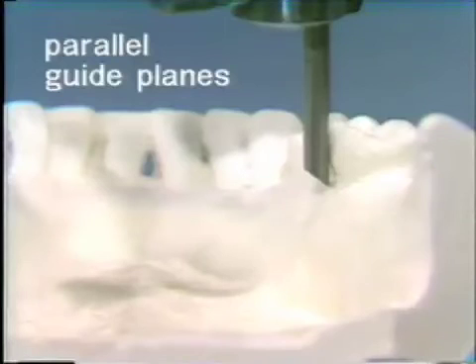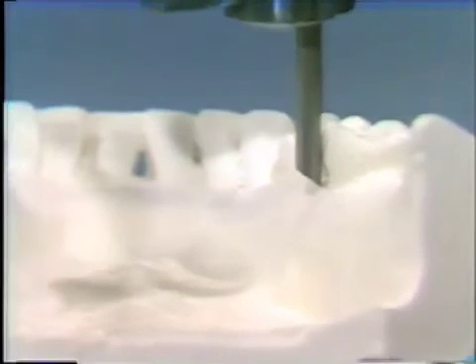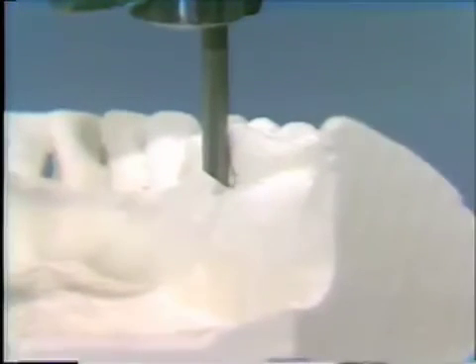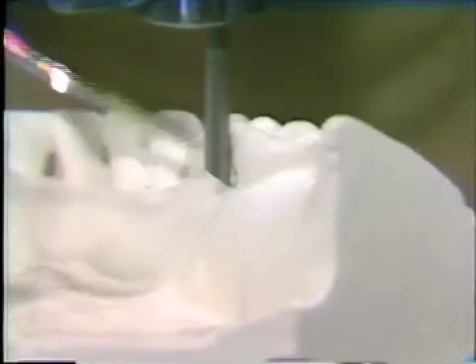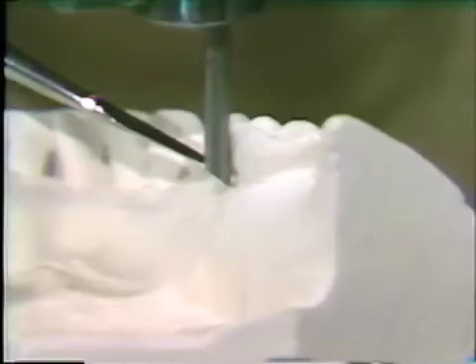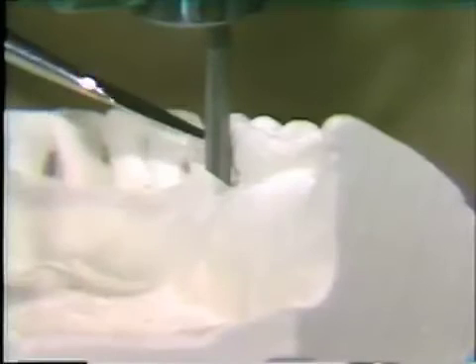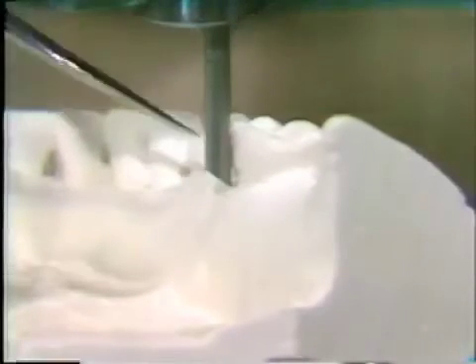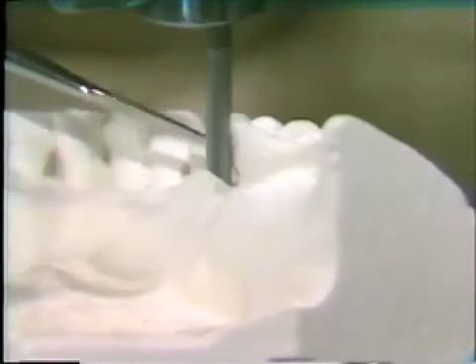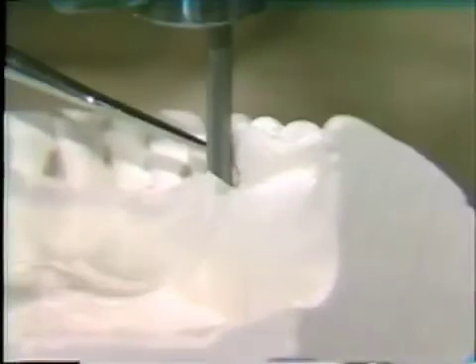Another use of the surveyor is to locate and plan for parallel guide planes on abutment teeth. A guide plane is an area on an abutment tooth which will stabilize the retentive clasp as well as stabilize the partial denture in place and guide the partial denture into place in the mouth. The surveyor would locate the area and determine just how much you would have to parallel the tooth in either the restoration or the tooth itself.